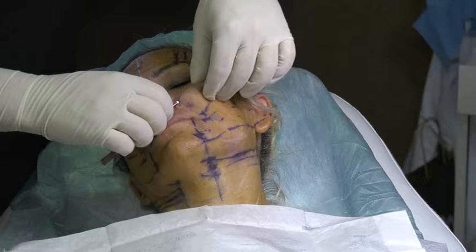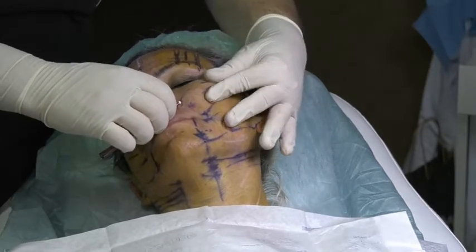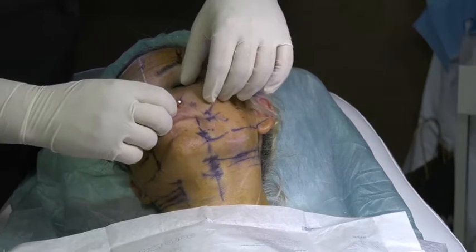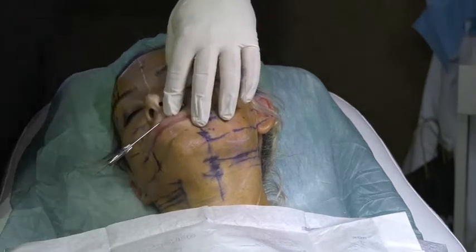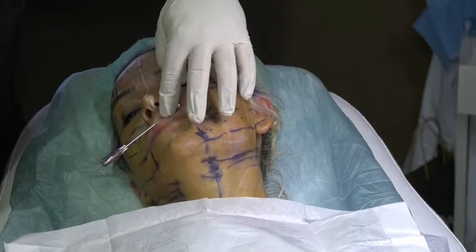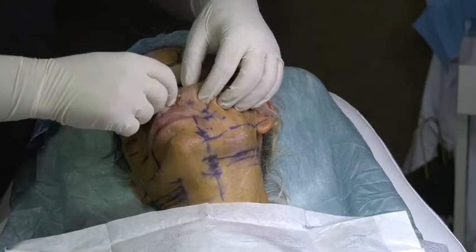My finger is standing up, not sleeping on the skin. Please remember that. I don't want you to do that. That's very difficult to drive. I want to collect the skin like that, so I am easy to drive. Also, when you drive, don't drive towards the dermis. Don't drive with that angle. Driving either horizontal or with little angle down. Okay? So, look at my hand to make a little angle down.